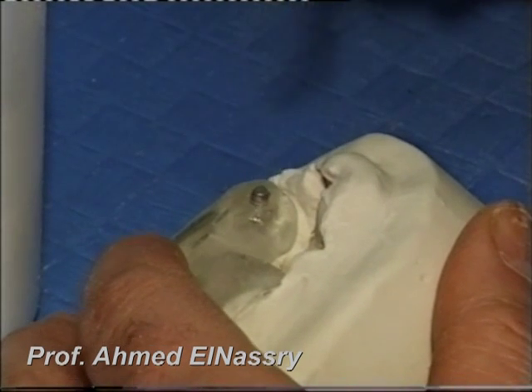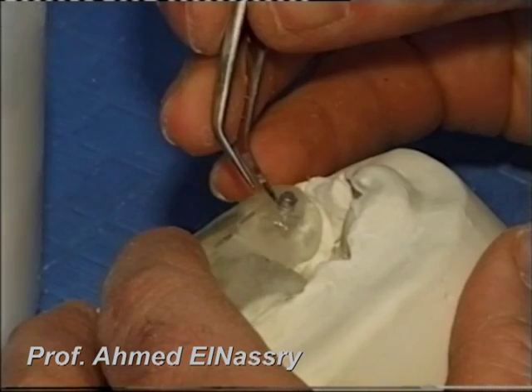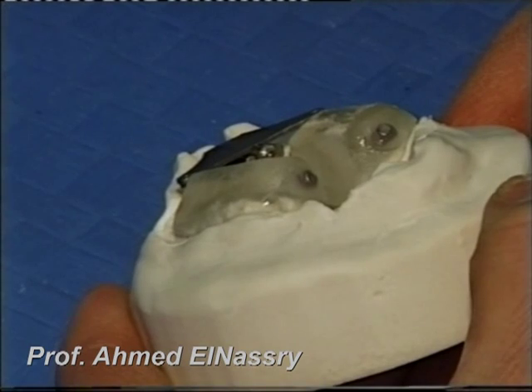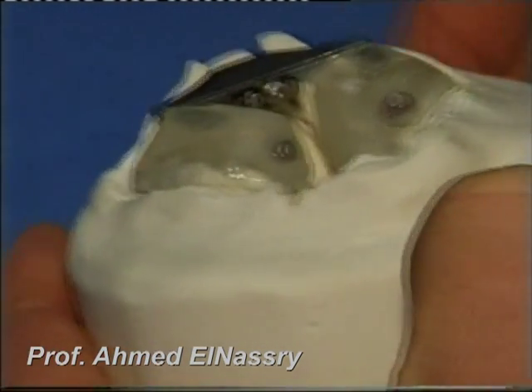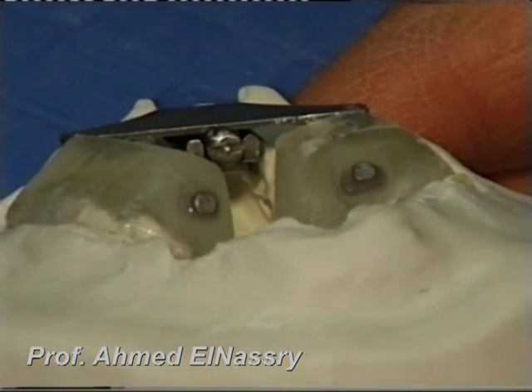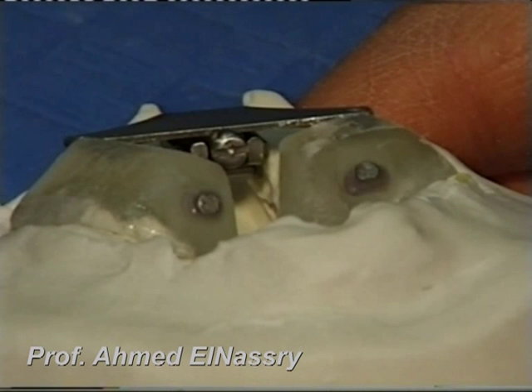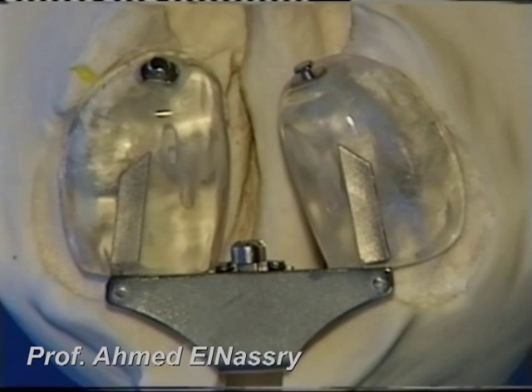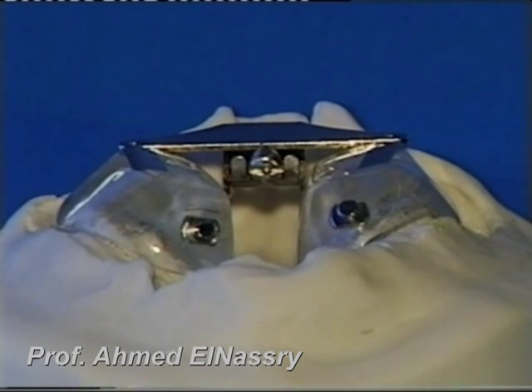After that, we insert the two buttons on the anterior portion of the acrylic parts. After curing and finishing, here is the finished appliance, which is composed of two acrylic portions and an expansion screw with two arms embedded in the acrylic parts, and anteriorly there are two buttons.